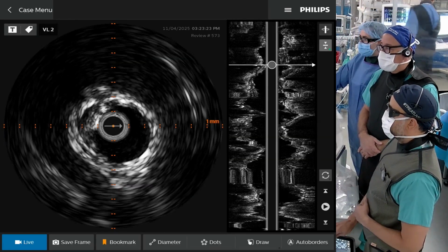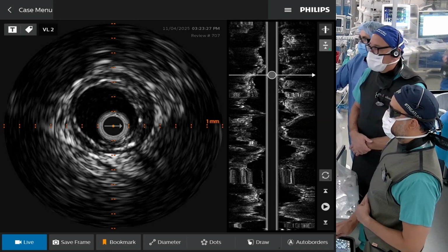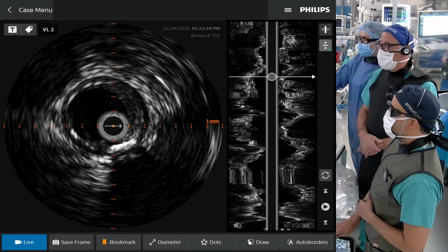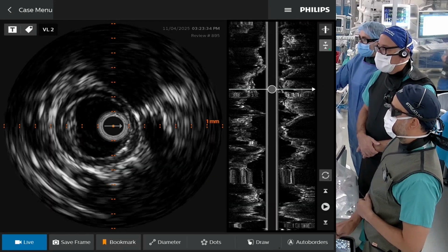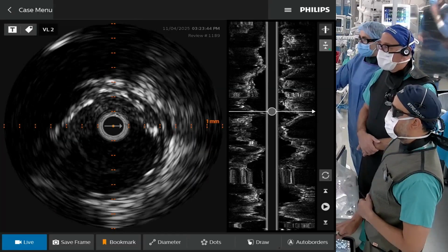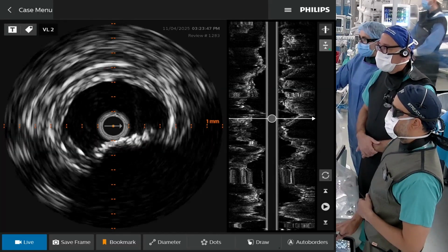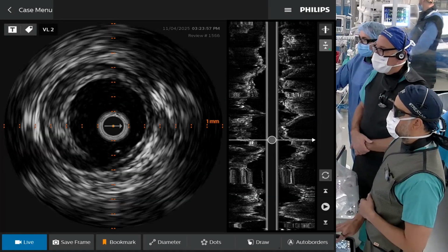This is going into, there we go. Now we're into the popliteal, distal popliteal coming in. Still some plaque, but it's significant luminal gain that we had before. Coming back up, now we're getting into sort of the pop SFA. Coming back up, some areas of some narrowing, but it's not that bad.